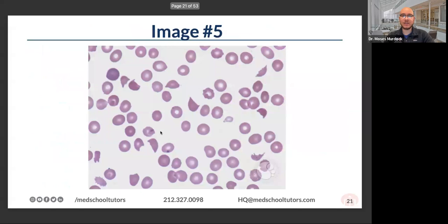All right. Next question here, and this is a must-know image. This is super high yield and very important to get on your exams. Go ahead and put in the chat what you think it is. And I'll answer while you all are putting in the chat what these are.